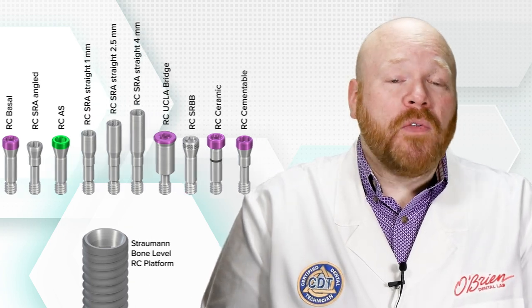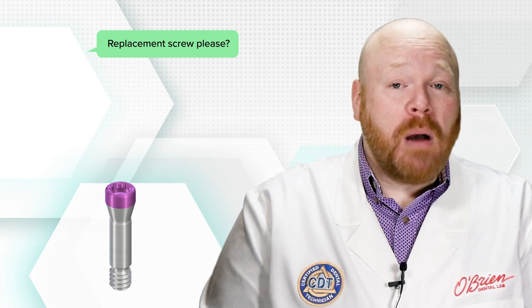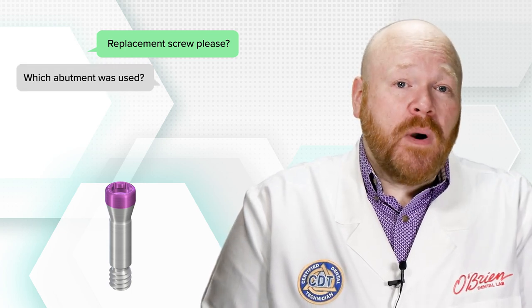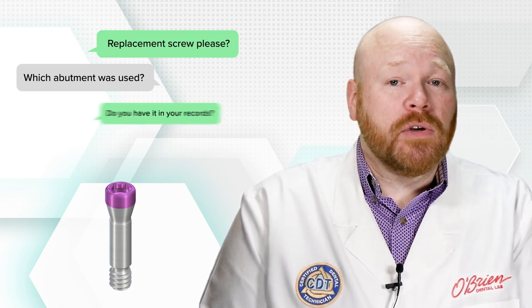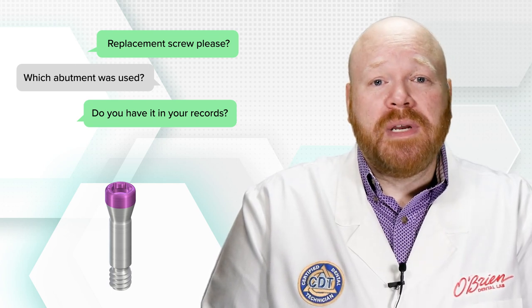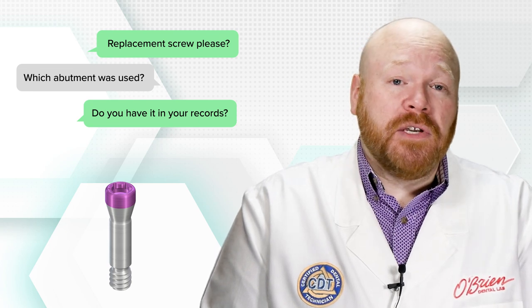This is why when you call the implant company or your lab and tell them you need a replacement screw, one of the first questions they'll probably ask is which abutment was used. If your lab is the one that provided the original abutment for the case, that information should be in their records. If, however, you're using a different lab, the best thing to do is to contact the original lab to determine what abutment was used.